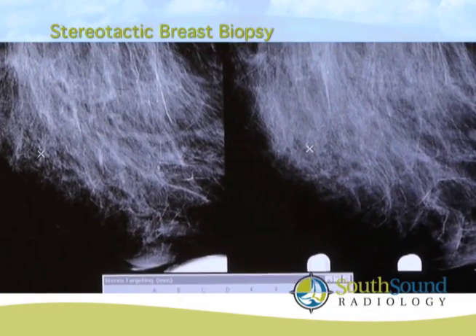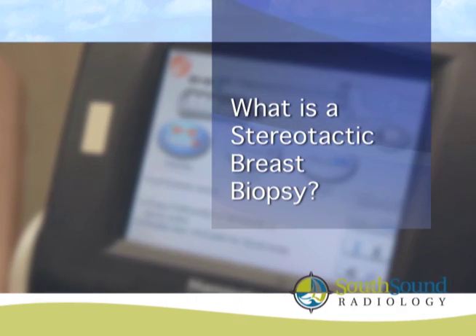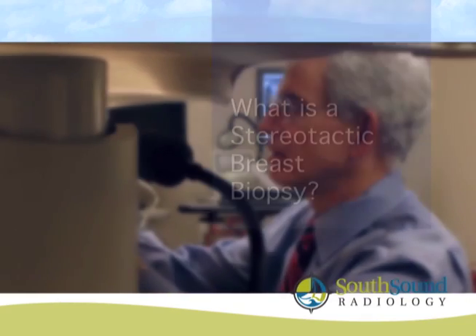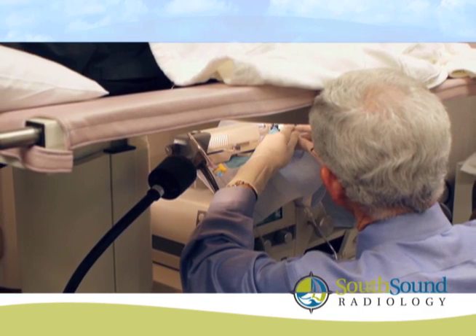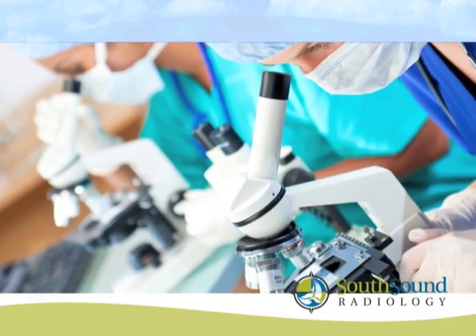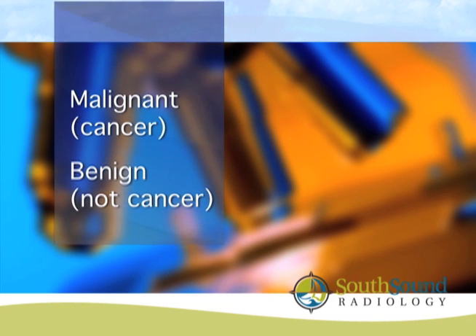An abnormality in your breast was detected during an imaging study. Your clinician has recommended a breast biopsy to accurately diagnose this finding. A stereotactic biopsy pinpoints the exact location of a breast abnormality using a computer and X-rays taken from different angles. During this procedure, a small amount of tissue will be obtained from the area of concern in your breast. A pathologist will examine this tissue under a microscope to determine if it is malignant, cancer, or benign, not cancer.